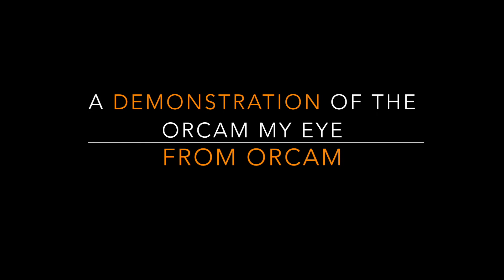The Chicago Lighthouse Assistive Technology Center presents a demonstration of the OrCam MyEye. Hello, this is Luke Scriven here at the Chicago Lighthouse. Today we're going to be talking about the OrCam MyEye, which is made by OrCam. It is an OCR device which can take a picture of text and read it aloud to you. It also has facial recognition and product recognition, which is really cool.